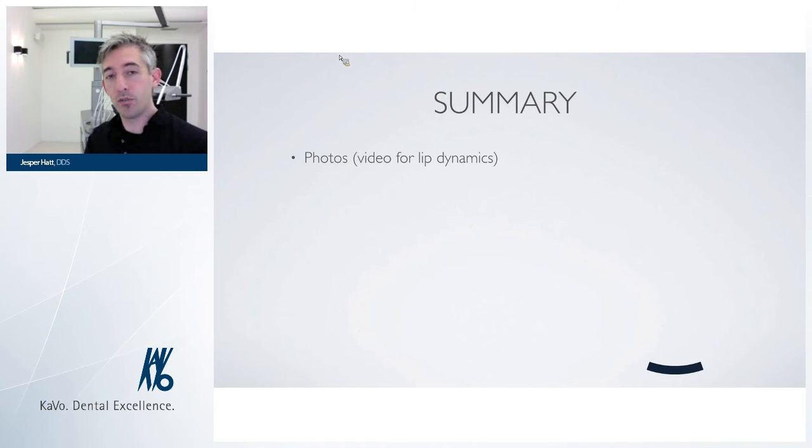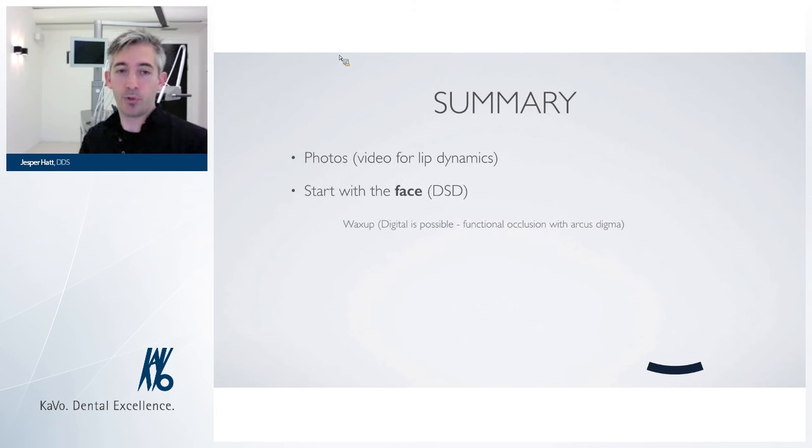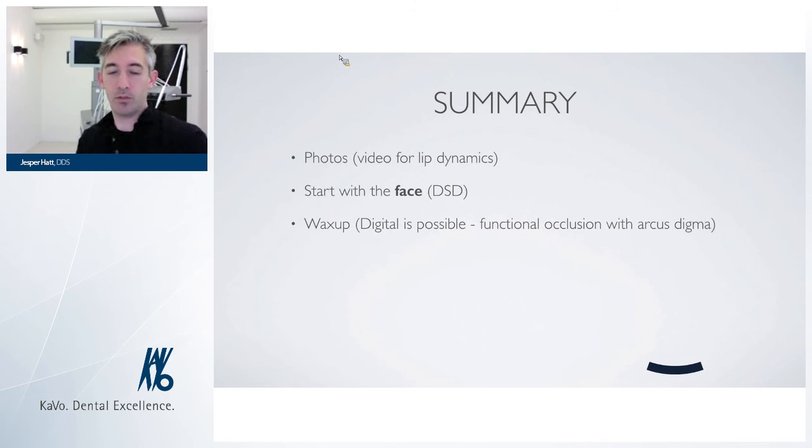You can use video for lip dynamics and to get an emotional connection with the patient. We always start with the face. We use the digital smile design. We do a WAXUP in regards to the digital smile design. We can do that either in our hands or digitally.